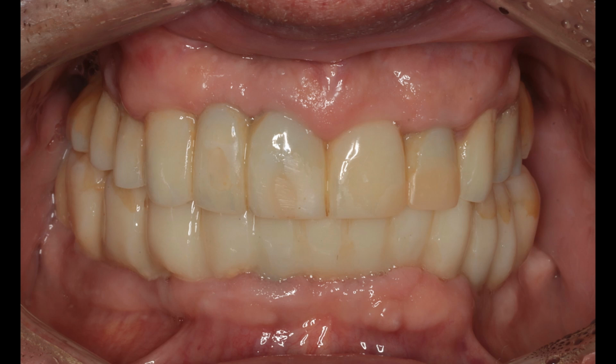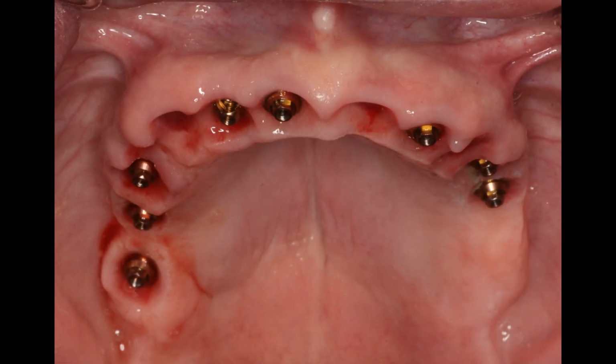Some of this staining, I believe this patient is a smoker. Of course, we discourage that. Smoking does decrease implant success rates. But this is some of the staining here, but the tissues look amazing. This is what we try to do all the time with our techniques. Just to show you what the tissues look like before the permanent restoration goes in.